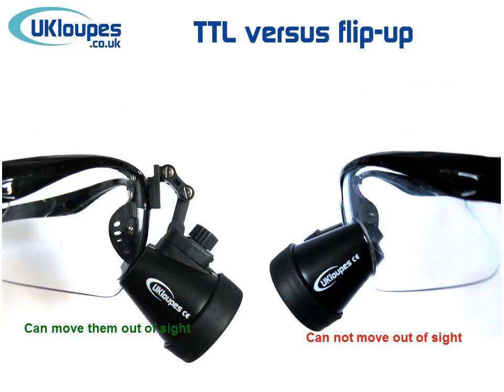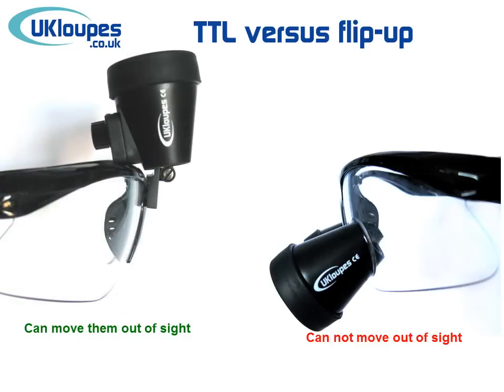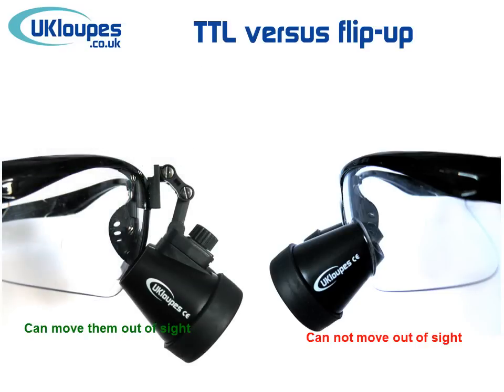Another benefit of having the hinge mechanism on loupes is that when performing tasks that don't really need full magnification, they can be flipped up and out of the way, out of the line of sight. With the correct hinge tensions, they can rotate only about the uppermost hinge axis, so when flipped back down, they should be in the correct position ready to use.